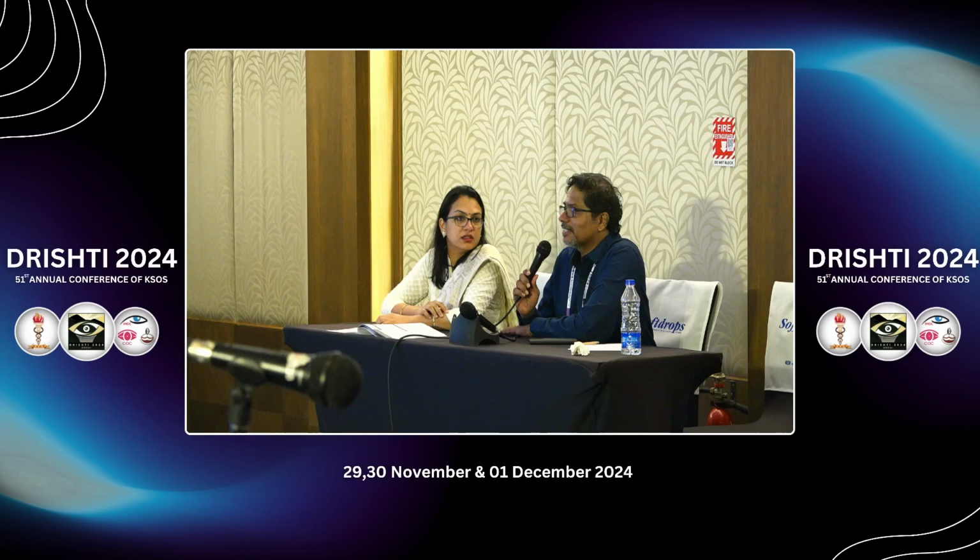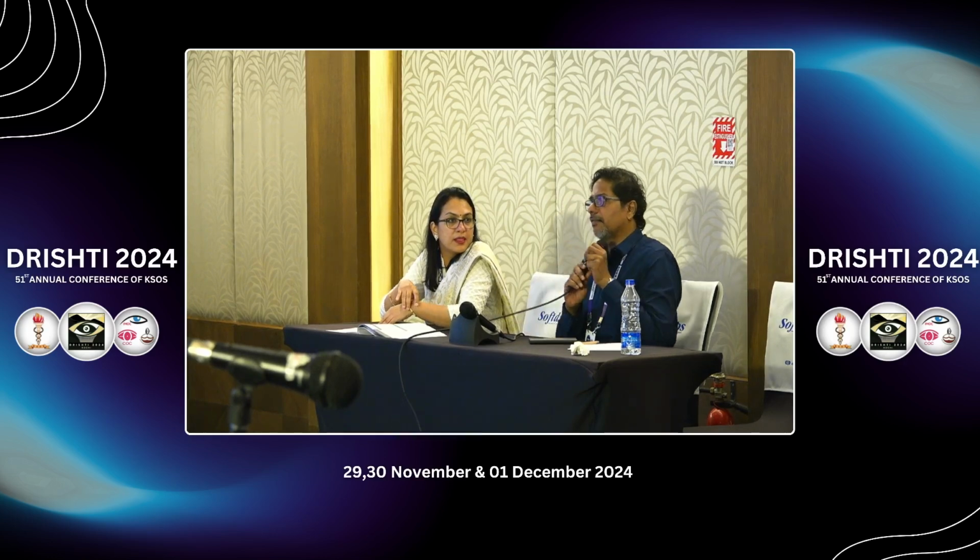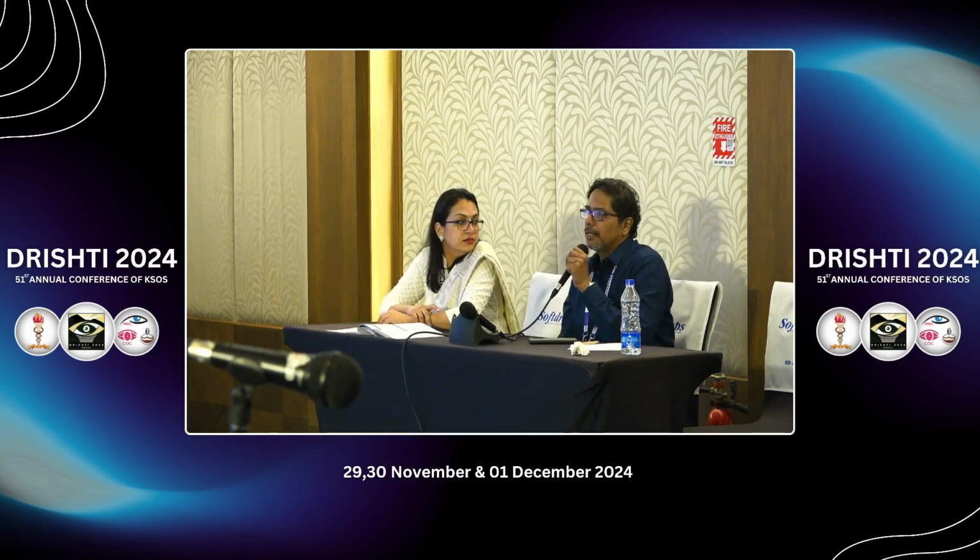I don't have much experience in this, but I have done a lot of cases with ring multifocal IOLs, where you have multiple rings, and it didn't seem to affect our visualization intraoperatively that much. I have done almost 4 cases of ICL with high myopia. I had RDs, and in those cases also we have done surgery, but it is not very limiting.